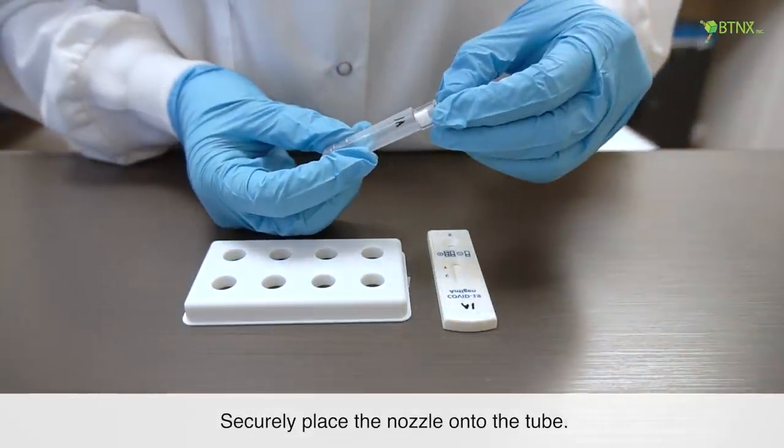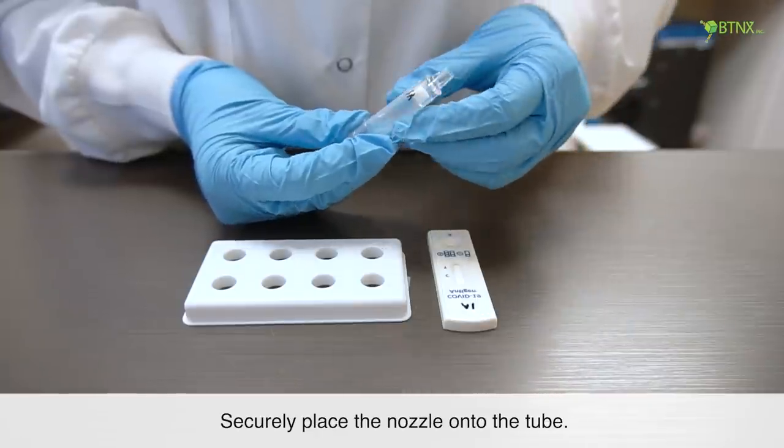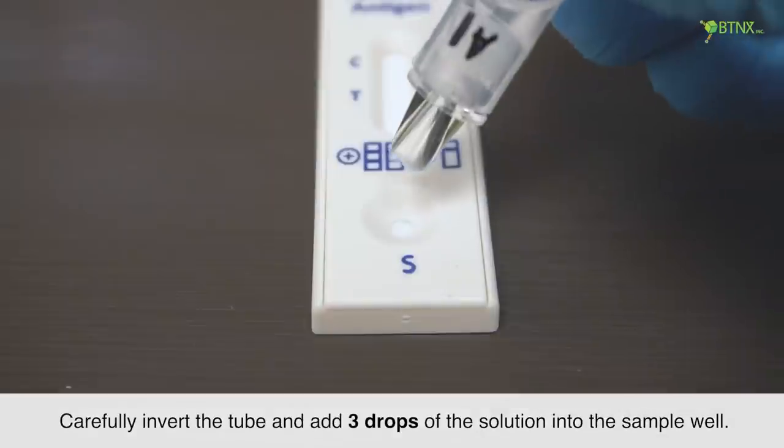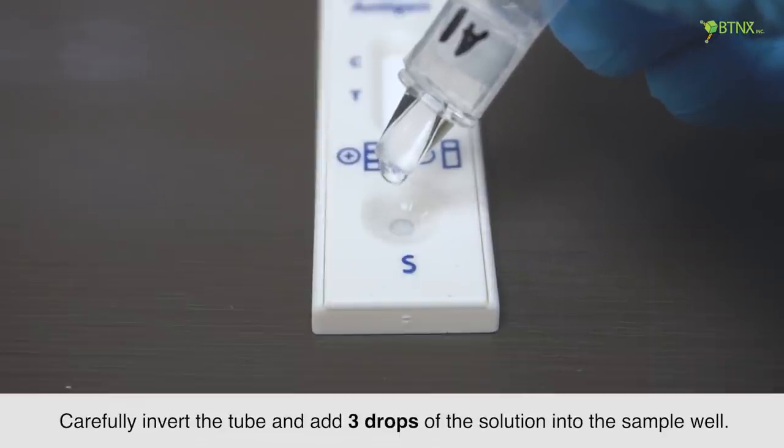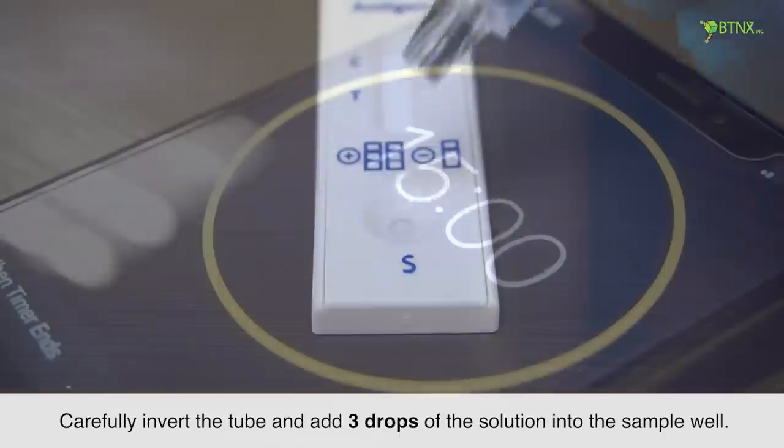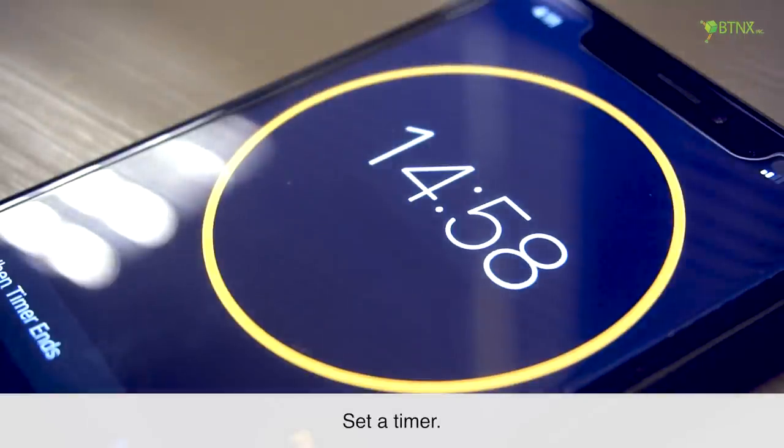Securely place the nozzle onto the tube. Carefully invert the tube and add 3 drops of the solution into the sample well. Set a timer and read the results at 15 minutes.